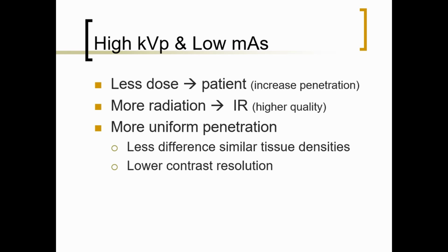This is why mammography uses low kV in a range of 26 to 30 kV to image breast tissue. Glandular tissue, breast fat, and breast masses are similar in density and can be small in size. So high mAs, low kV techniques maximize the chance of the computer visualizing the pathology.